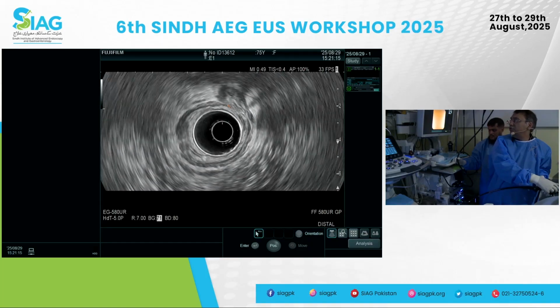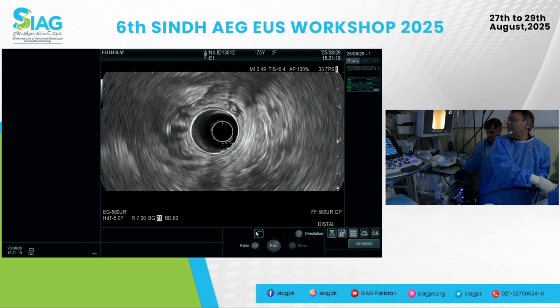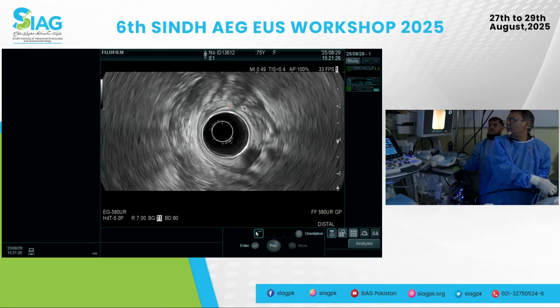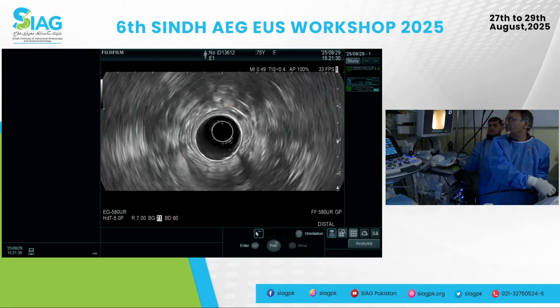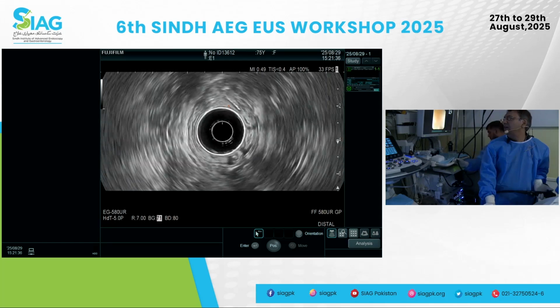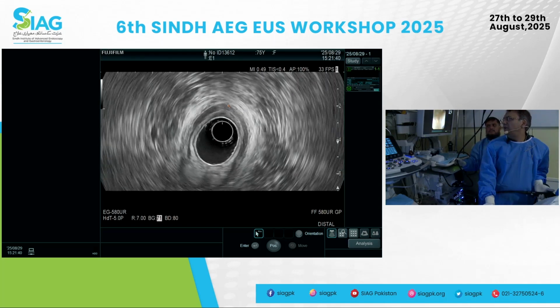One other thing I do is, if I've got to see one side of the wall, I will lean with the balloon on that side. Looks pretty good right there. I lean on the other side. Looks pretty good there. Now I can use the big wheel and the up and down and lean on the walls on each side. I have not seen any mass there, and even here, pretty okay.